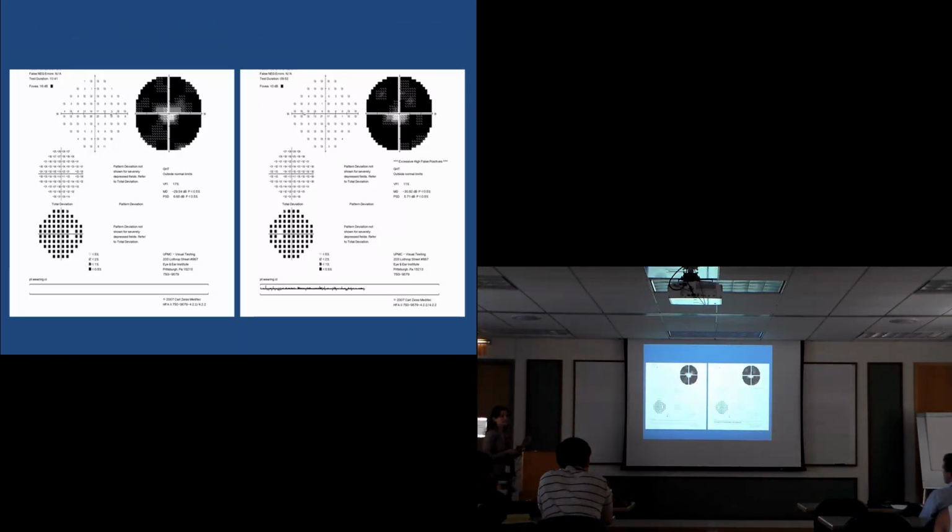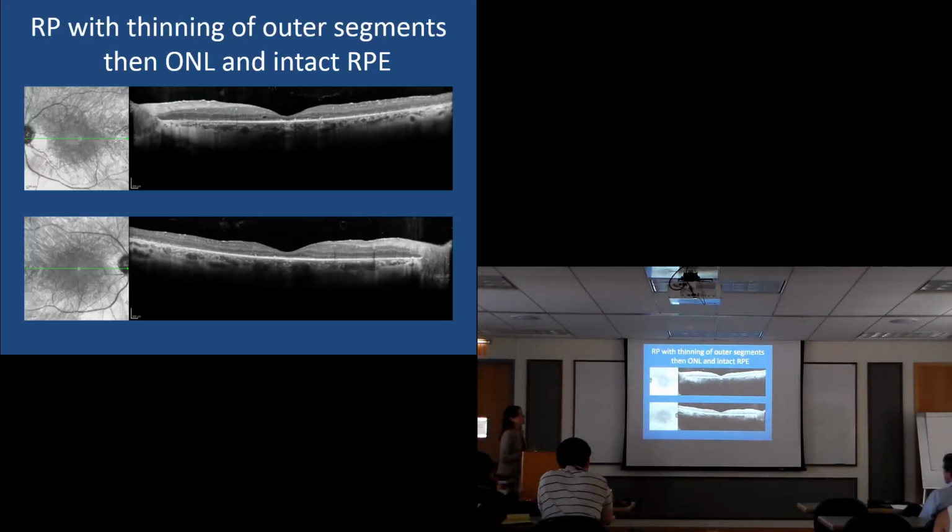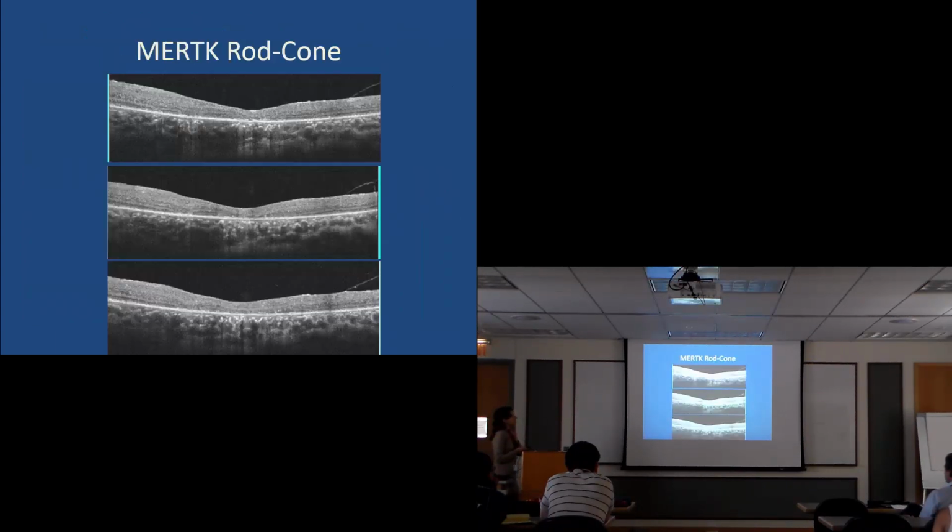And in a young patient with tunnel vision and that kind of changes, her diagnosis becomes retinitis pigmentosa, which is really the opposite of the last patient. This is atrophy of only the photoreceptors. So the inside of the retina stays healthy. She probably has good blood flow. There's nothing wrong with her vasculature. But the photoreceptors, if you remember to look for those bands, you start to lose the bands, and you really have to look at it that specifically. This is what she has.